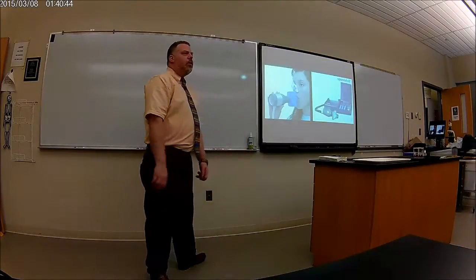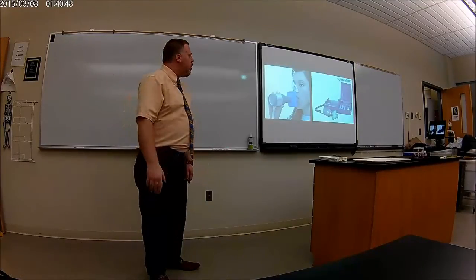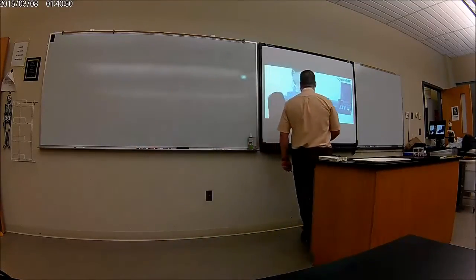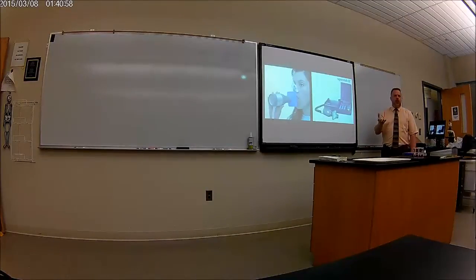This is what spirometry is. Who here has done spirometry sometime in their life? Okay, about half of you. All right, basically what it is, you've got to blow into this machine. It'll collect the amount of air, and then you also have to inhale too. First you exhale everything first. This is what I would be doing with the machine if it was calibrated, but we don't have it calibrated. So what it'll do is that you exhale everything.